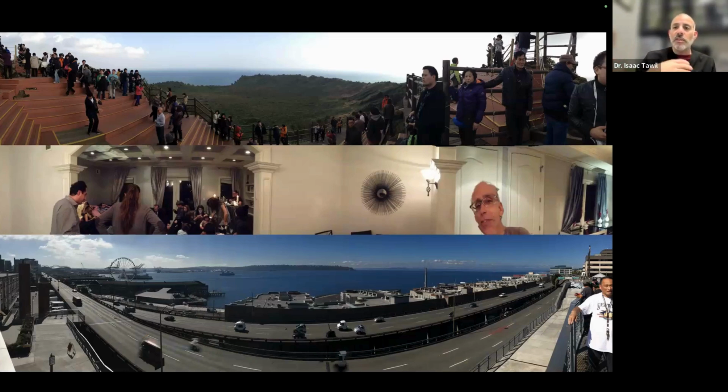The patient's mouth may move, the tongue may move, and this is going to create stitching errors. So stitching cannot be the solution until the algorithms catch up and improve. Do I believe that one day intraoral scanning will be good enough for all of this? Yes, I do. But is today the day? Unfortunately, it's not there yet.